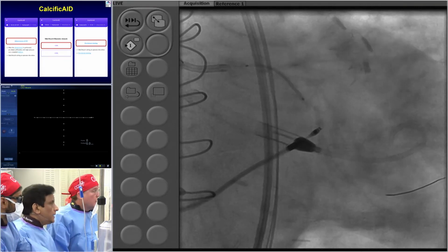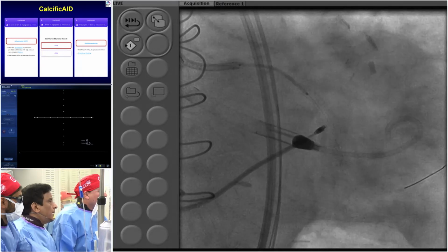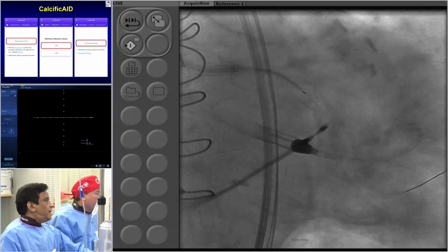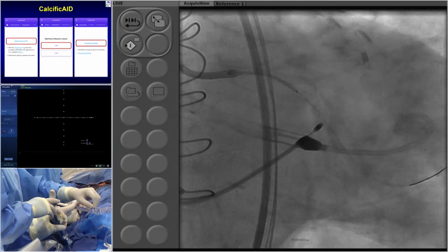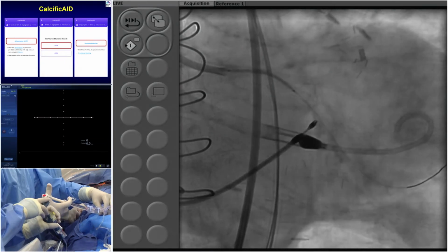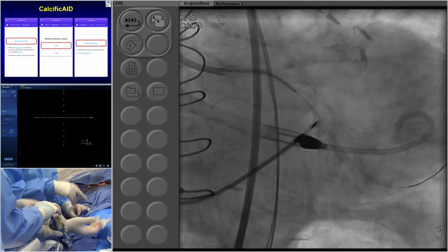What markers are you using, how are you making sure they overlap, all that. All right, so you overlap at least one cell. But remember this, the dot is actually outside the stent. This is the key with these stents. Guide back out. You have to be on the safe side distally so you don't miss the segment. But most important is to cover your lesion in that left main. Very good. Yeah, exactly. Now we're perfect. Go ahead.